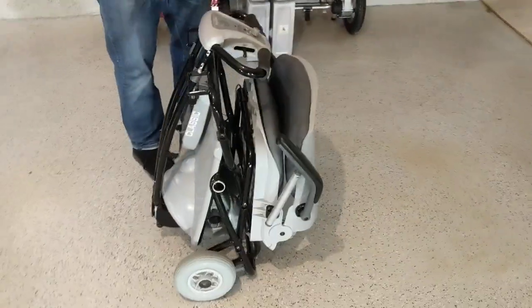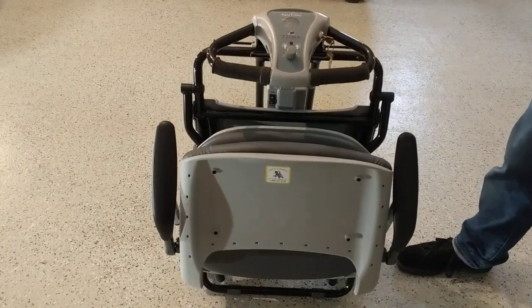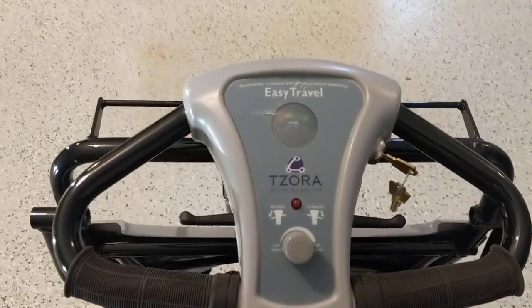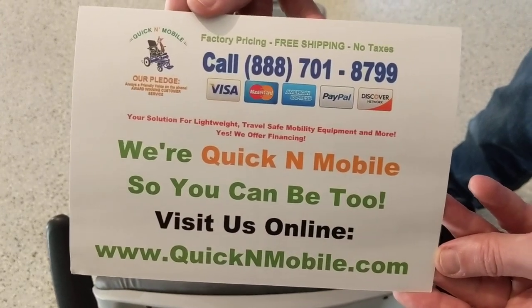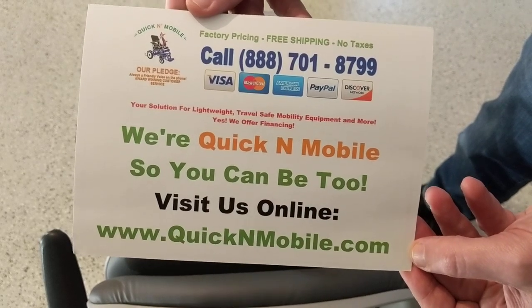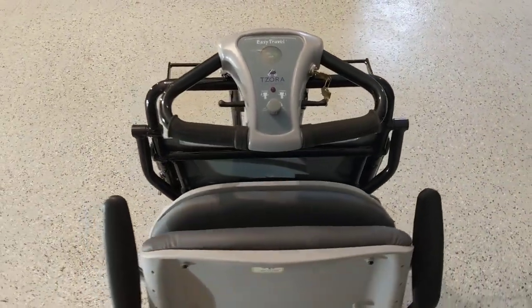Hello, this is Paul from Quick N Mobile, and right here, right now, today, we are here with a fully folded up Lexis Light folding portable mobility scooter. We're going to go over folding it, unfolding it, taking it apart, troubleshooting it, and giving a lot of details about the device. We are Quick N Mobile — you can visit us at www.QuickNMobile.com. Let's get to the Lexis Light portable folding mobility scooter.